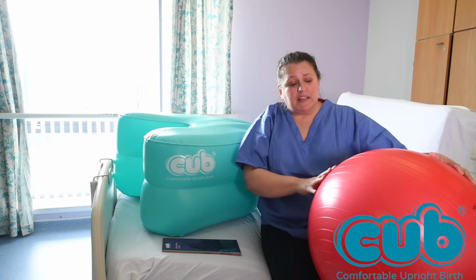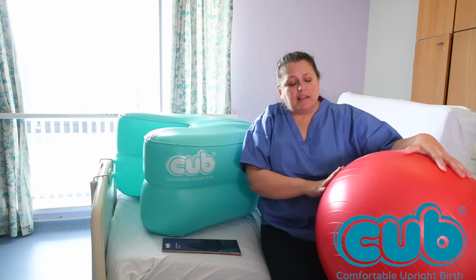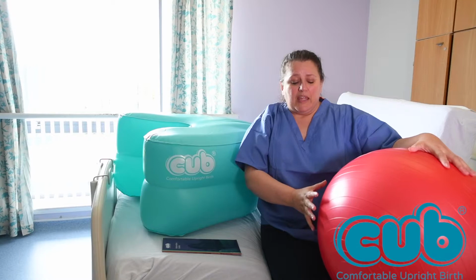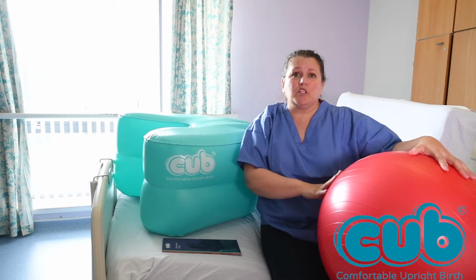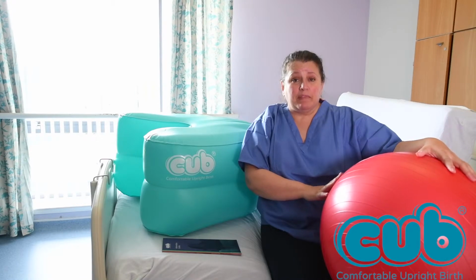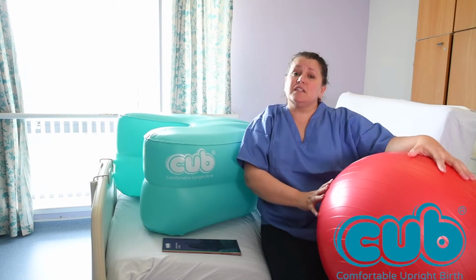The other problem with it is they're very difficult to keep clean. Now, some people do have covers for them, and that's absolutely fine. The other negative about them is that they are not biocompatible. They were never designed for use in healthcare, never mind for mothers having babies. They are inexpensive and very flexible because they use a lot of very cheap plasticizers in them that makes them more flexible. So they're not ideal to be used against somebody's skin for extended periods of time either. The other very obvious thing, although people call them a birth ball, nobody can give birth sitting in a ball. It just doesn't happen. So they have their limitations and they have their uses.